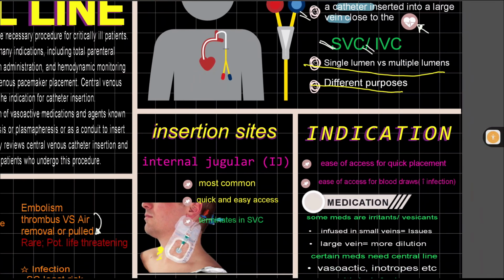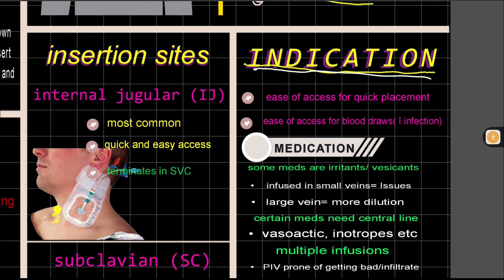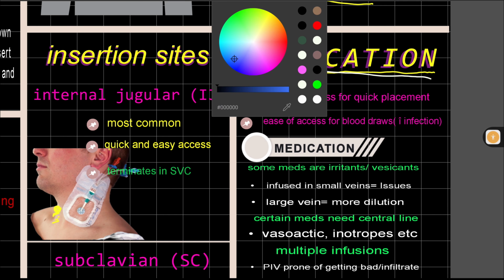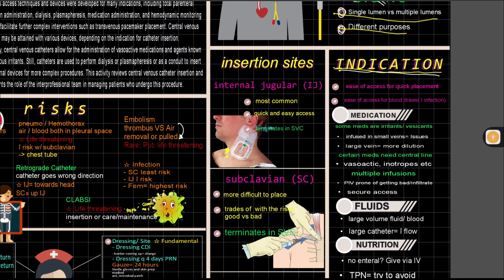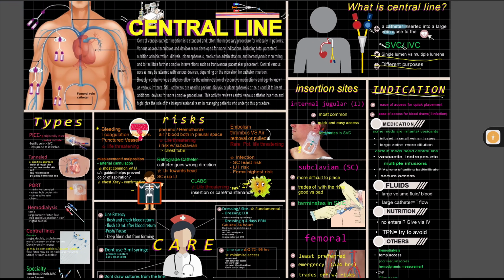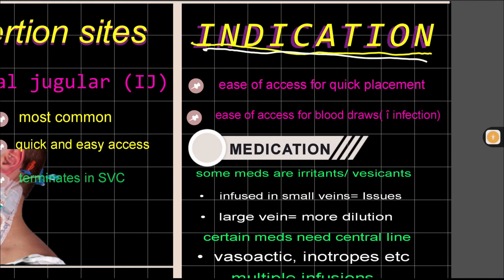Now, let's discuss why we are going to insert central line to our patients. What is the indication of inserting central line? All right, we're going to discuss this now. Let me just change my pen color here. I think blue is nice. All right. So indication. I listed down several indications here, and I'm going to discuss them one by one. Now, indication of your central line.